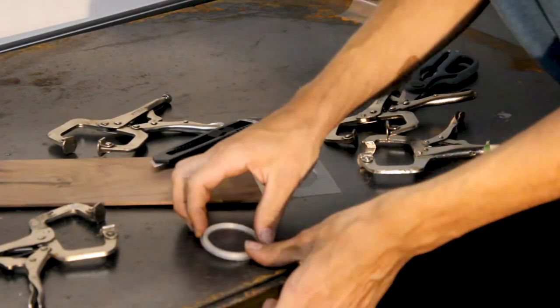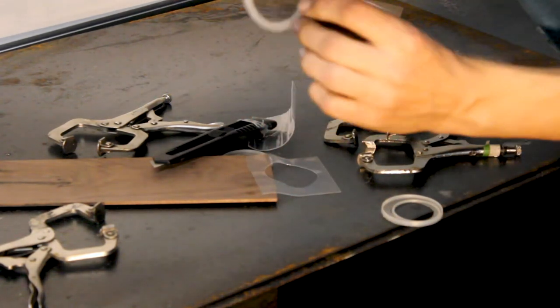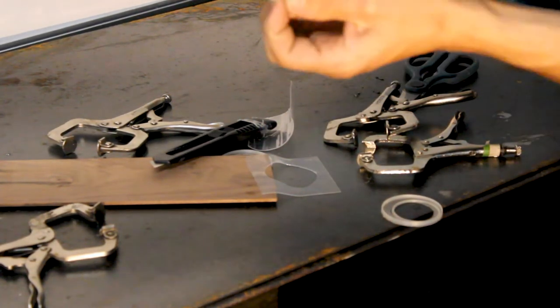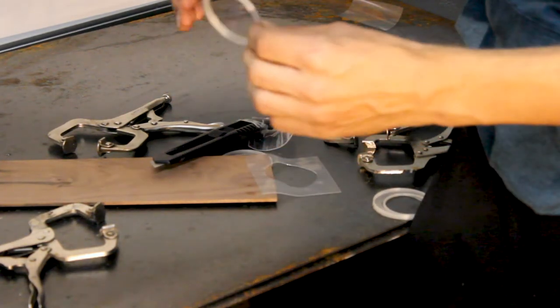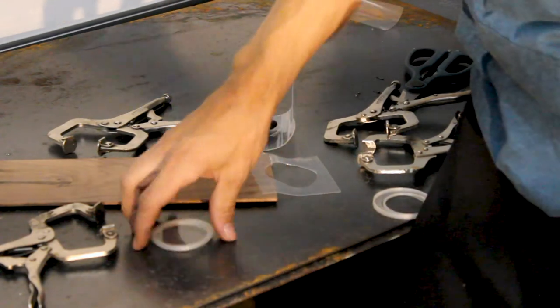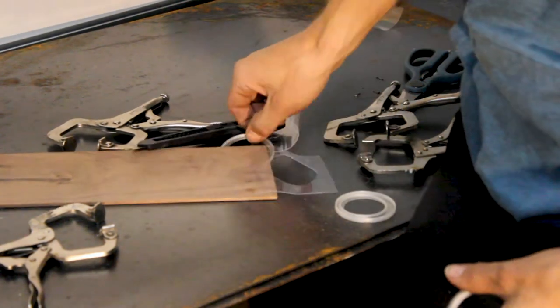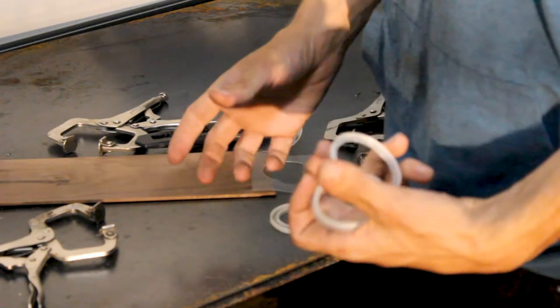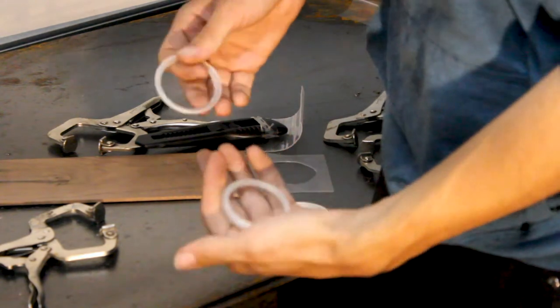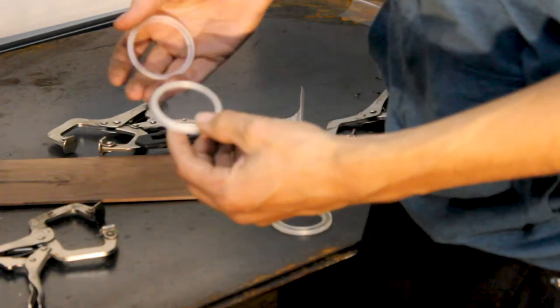Cool. Great. And you'll notice it makes a really cool drum sound. This one's pretty high pitched because I got it so tight. And then next we'll go over to the sink, and I'm just using water right now. Eventually I'll do this with propylene glycol and fill it with some sort of oil-like substance.